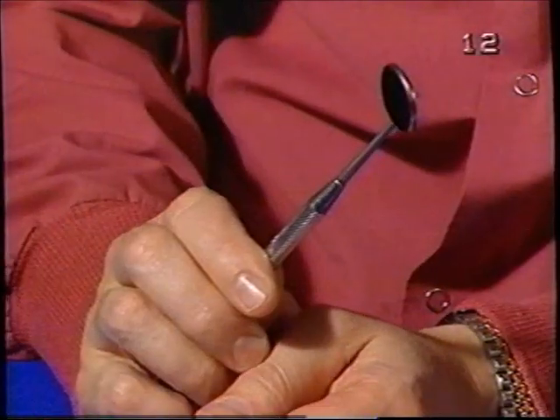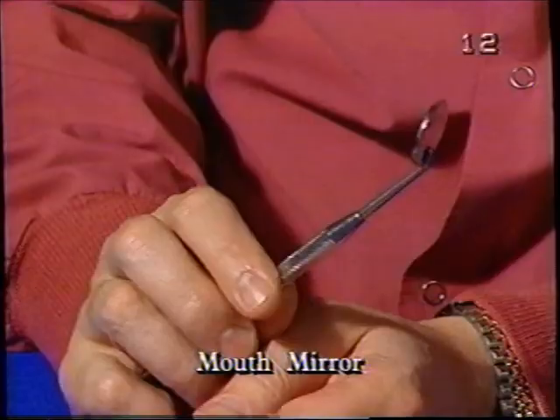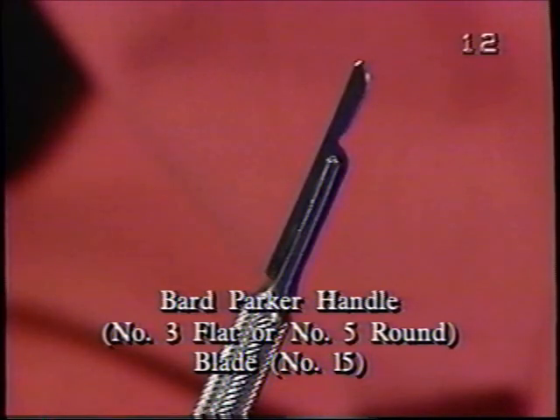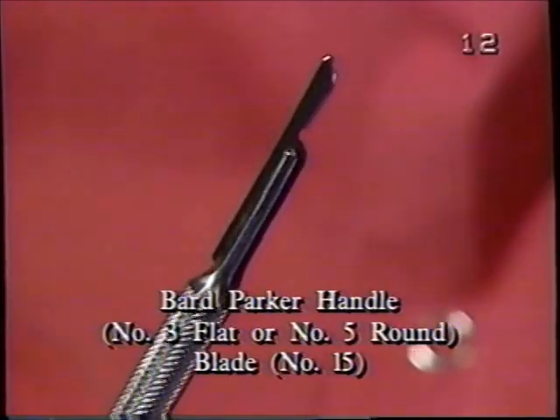To look more closely at the surgical area or to retract the cheek, we definitely want a mouth mirror. Next is the Bard Parker, and the blade that I most generally use is the Bard Parker number 15.